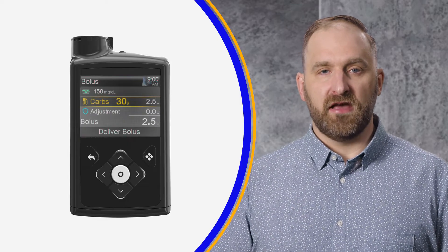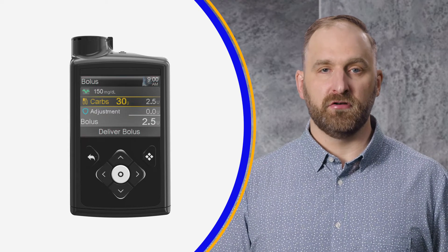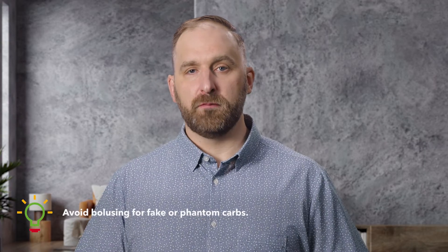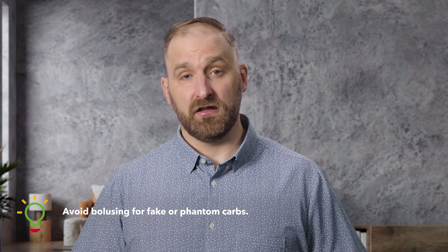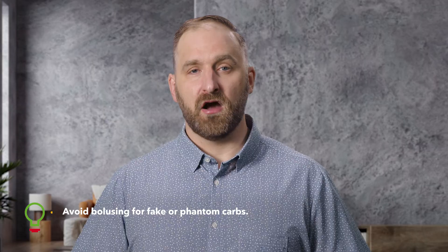All you'll need to do is enter the estimated grams of carbohydrate you're about to eat, and the system will calculate the recommended insulin dose for you based on the settings programmed into the pump by your healthcare provider. If you need to add more carbs later for additional foods eaten, you can. Make sure to avoid bolusing for carbs that you're not eating — we call these phantom or fake carbs. Doing so may cause you to go low.